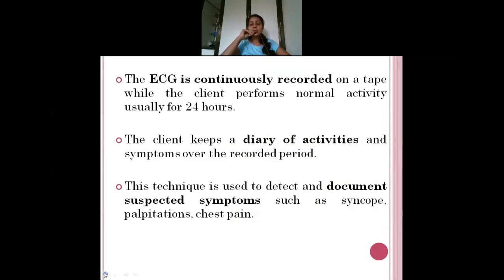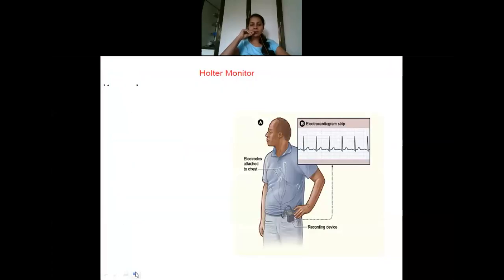Some other points. You should remember that the Holter monitor is continuously monitoring your electrical heart rate or heart rhythm for 24 to 48 hours, and you have to maintain a diary of events, whatever is happening to you. Suppose when you are sitting, or eating, or after eating you experience any symptoms, like palpitations, or slight chest pain, or fainting episodes, everything you should maintain in your diary clearly. Maintaining that is also very, very essential.